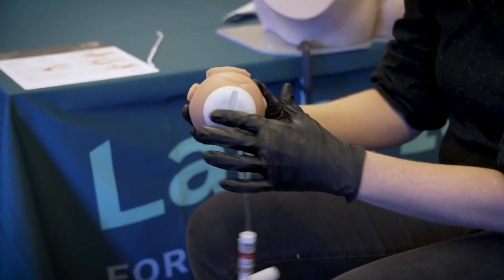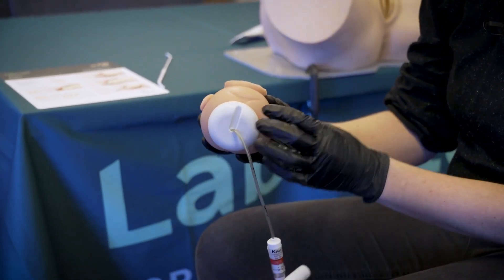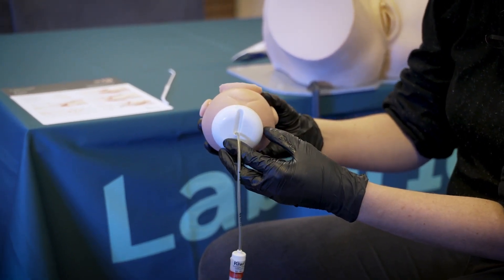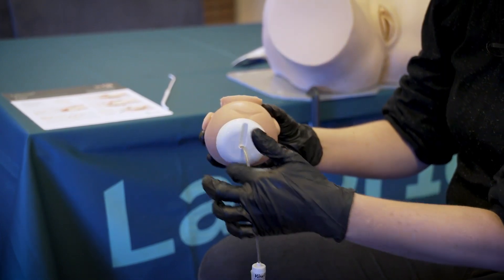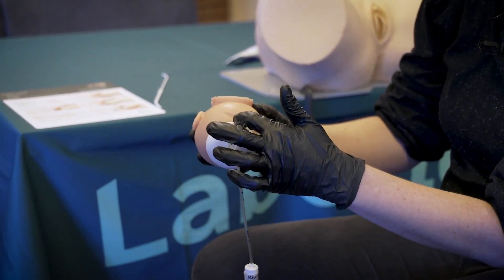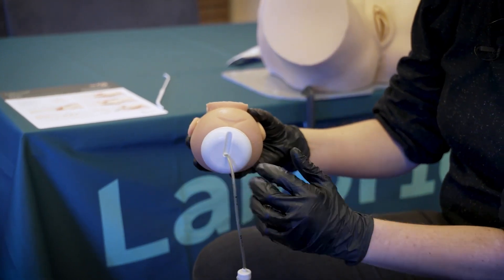One way to avoid a pop-off is always making sure that your cup is placed nicely over the flexion point. We don't want a lateral placement or a placement nearer the anterior fontanelle. We want the cup nicely placed with the center of the cup over the flexion point, which is three centimeters from the posterior fontanelle along the sagittal suture.